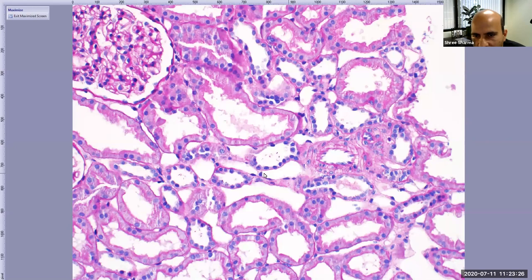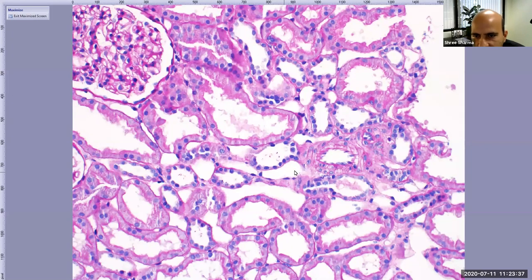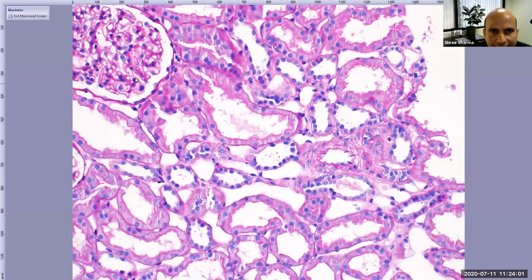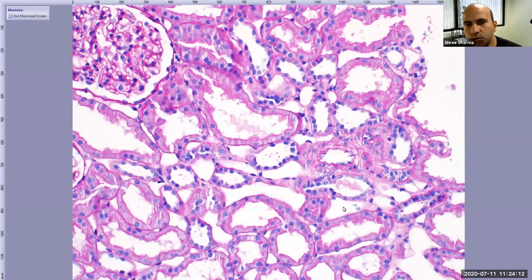If you compare the proximal tubule with the distal tubule, you cannot see the ample pink cytoplasm or the brush border in the distal tubule — that is why this is a distal tubule. There is another structure in between the different tubes: the peritubular capillaries. These have practically no wall — almost a thin wall — but you can see a few dark nuclei lining it. Similar to the capillaries in the glomerulus, these capillaries are present within the interstitium.